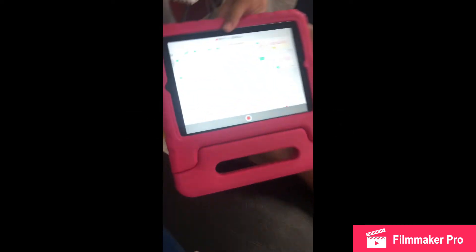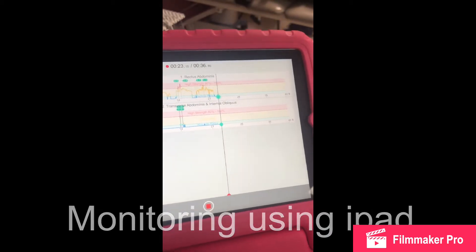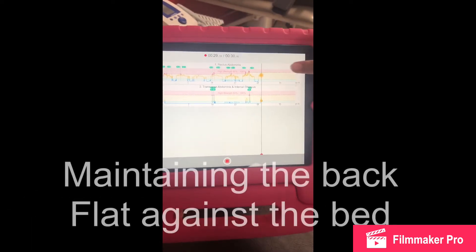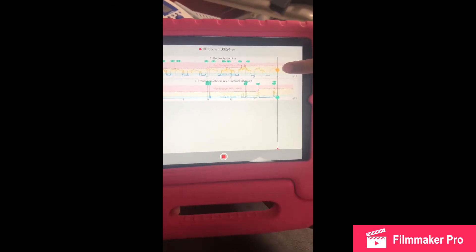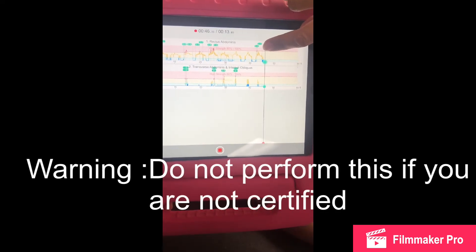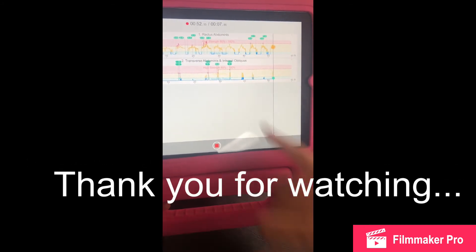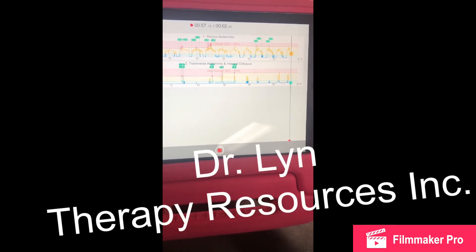So this is what it's going to look like. She's doing 30 straight leg raises — press your back against the bed and tighten your abdominal area. Her goal is to reach the red line there, and she's reaching it right there. She's firing it pretty well. She's averaging 80 to 100% of the contraction of the muscles.